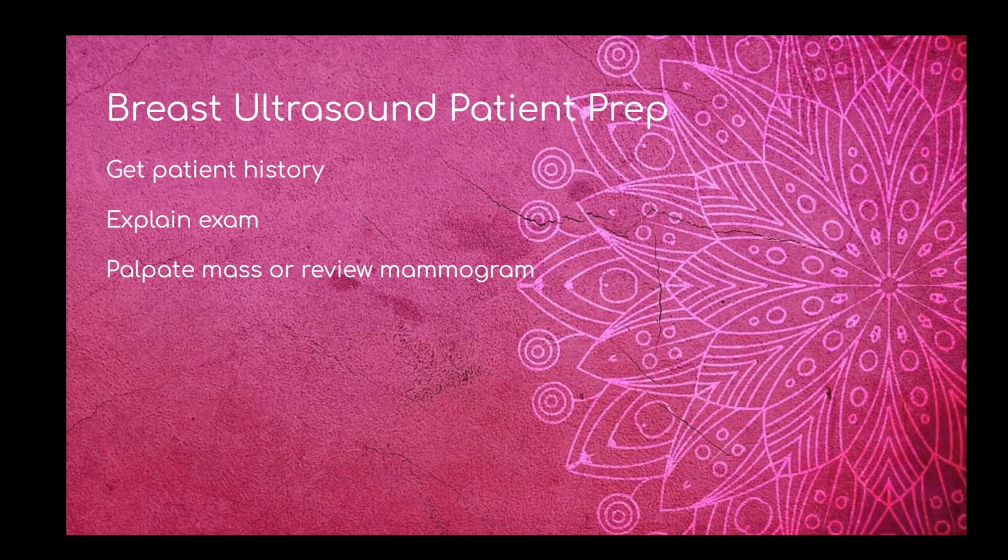If you're following up a mammogram, then you definitely want to review the mammogram. You will learn how to read mammograms, but as I mentioned in that video, you are not usually going to have to read a mammogram and then go scan a patient. Typically you have a radiologist on site, or you have a radiologist available by phone that will review the mammogram with you, tell you where to scan, and confirm the location.